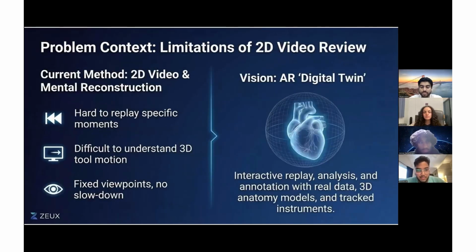The problem we're addressing is how to help surgeons and trainees review mitral valve surgeries in a more interactive way. Right now, they mostly rely on 2D videos and mental reconstruction. That makes it hard to go back to specific moments in the procedure, understand tool motion in 3D, and slow things down or rewatch sections from different viewpoints.